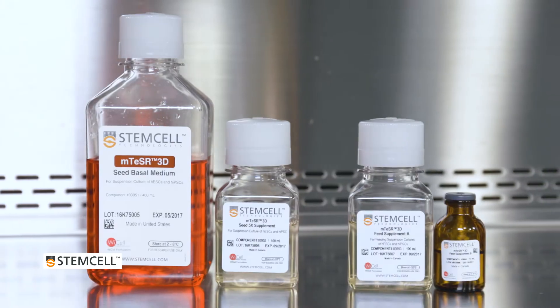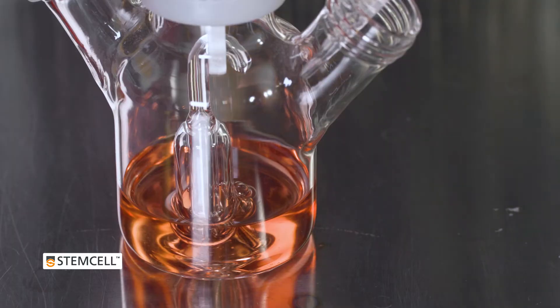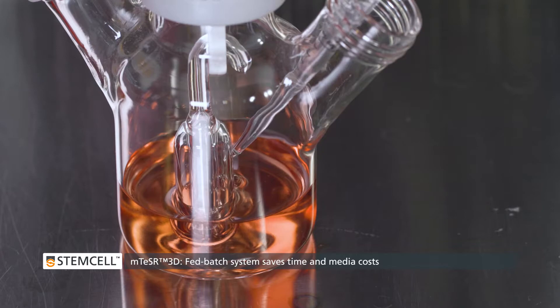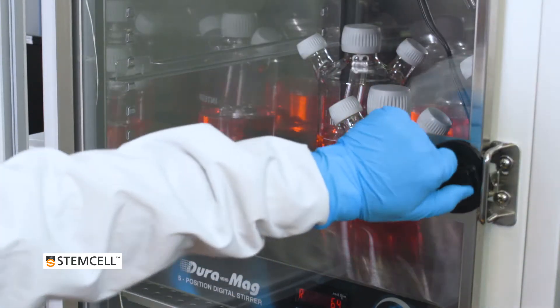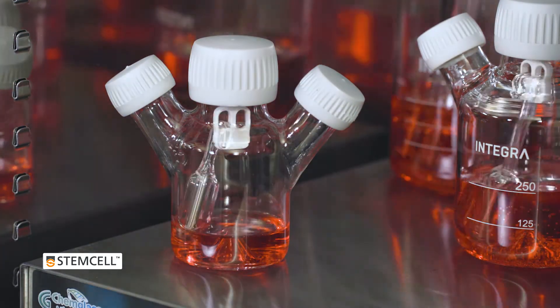M-Teaser 3D is a defined and serum-free culture medium, optimized for human PSC suspension culture. It is designed as a fed-batch culture system. Required nutrients are added daily, eliminating the need for daily medium exchanges, saving you time and reducing your medium costs.